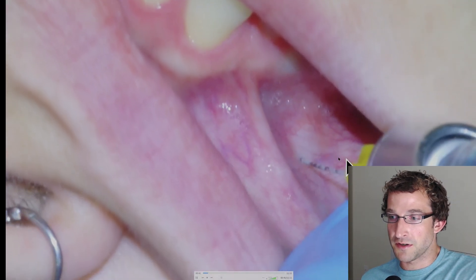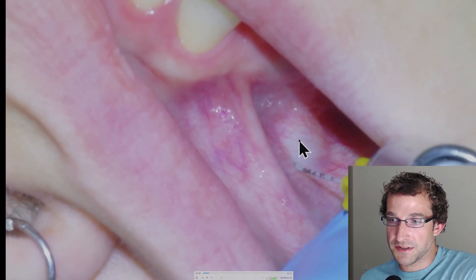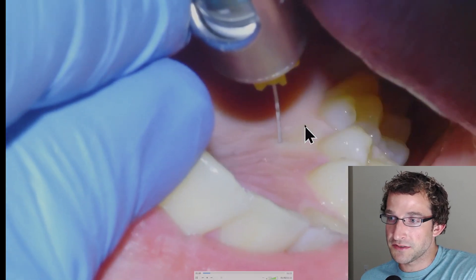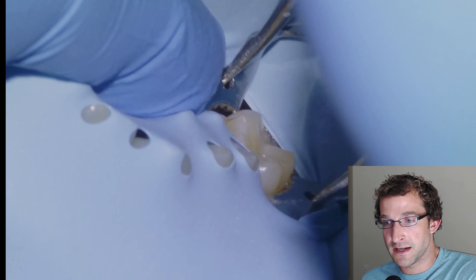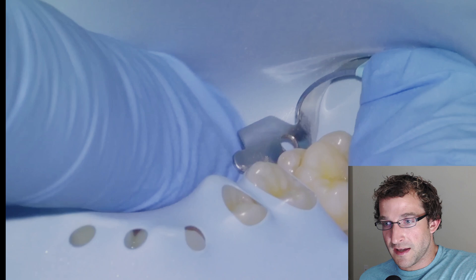We're going to put 1-in-200 articaine into the buccal vestibule, and then I personally like to anesthetize the palatal gingiva any time I'm doing an upper Class II restoration. Then we'll put a rubber dam on from the six to the midline. It's a little tricky with the clamps, but we'll get the clamp on the six.